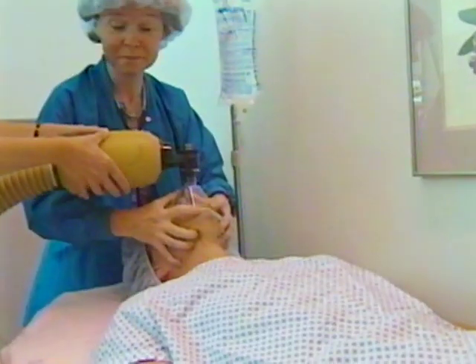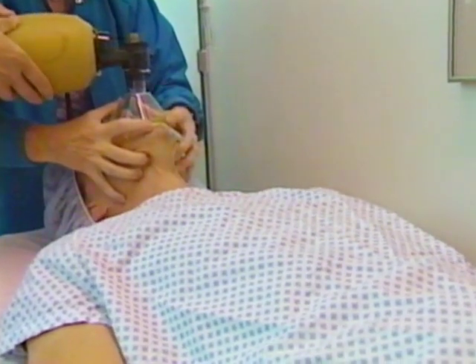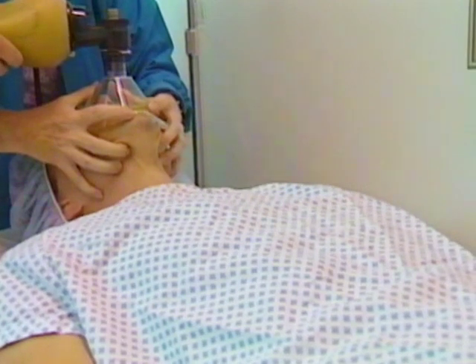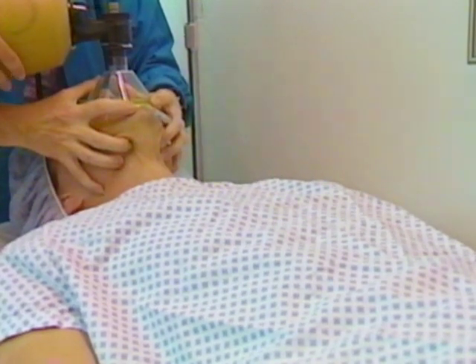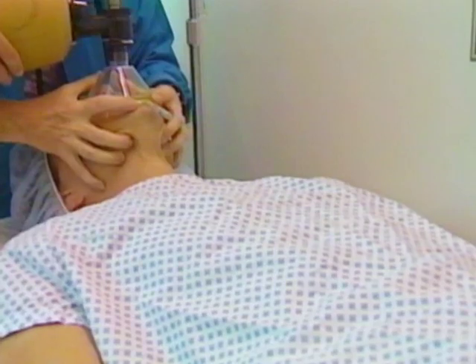When someone else is squeezing the bag, it's especially important to watch the chest rise and listen to breath sounds to verify adequate ventilation, since you can no longer feel the compliance of the bag yourself. Make sure your helper communicates any signs of obstruction or lack of seal to you immediately. This technique is a team effort.